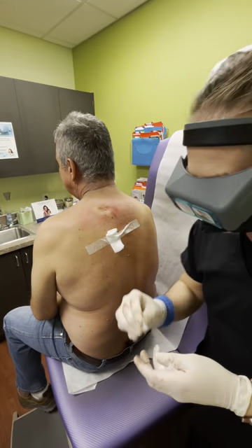This here is part of the sack. It looks different — the contents are different. That's the sack. Can you give me another glove? I think we're done. Is it done? Nope — silly me, it's not done. It's bad. Okay, let's do it. This is the end. Is it okay? Yes. Thank you very much.